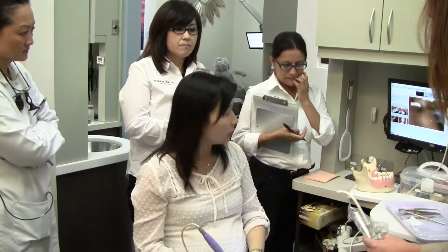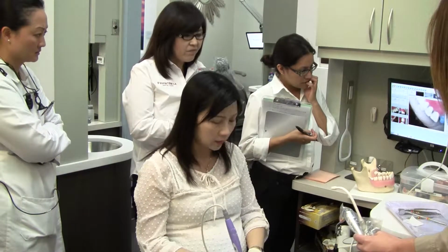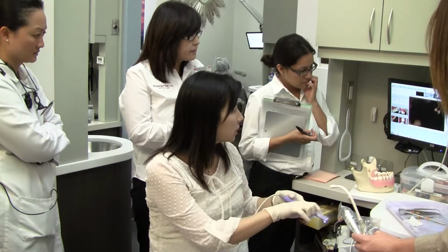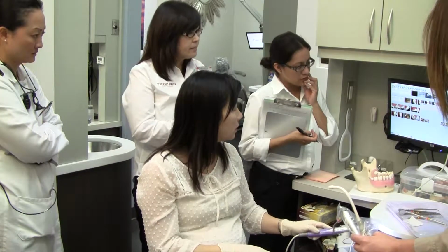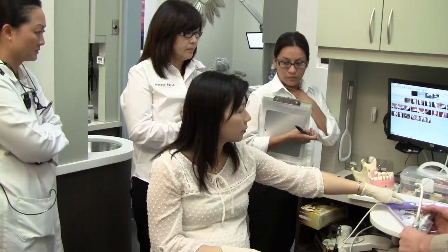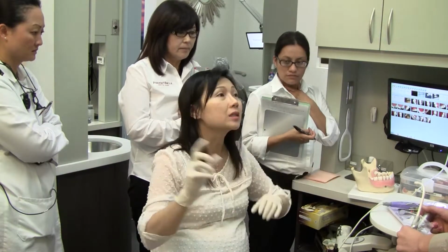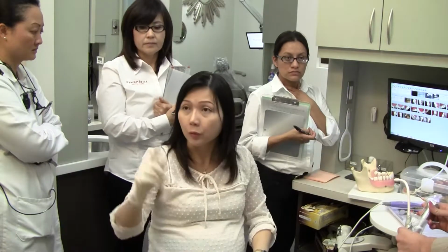So then snapshots, a bunch of snapshots, right? And then you have to get 4 images. Once it does that, you have to click auto number, and then it's done. And then leave this camera on. Even while I'm showing, don't take the camera away, because it freezes the software. So leave the camera on and connected, even when we sit the patient up.